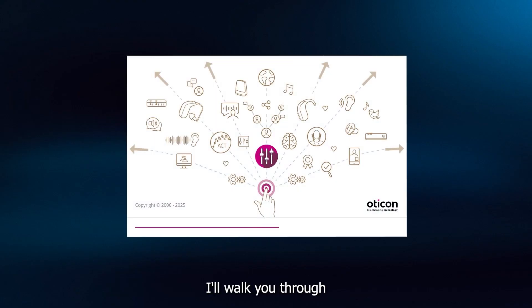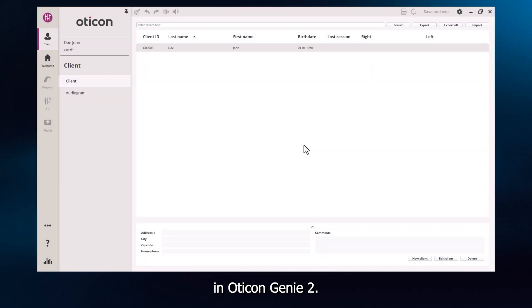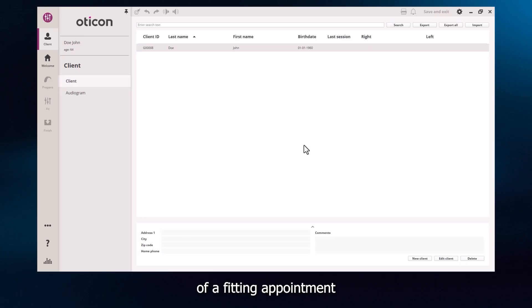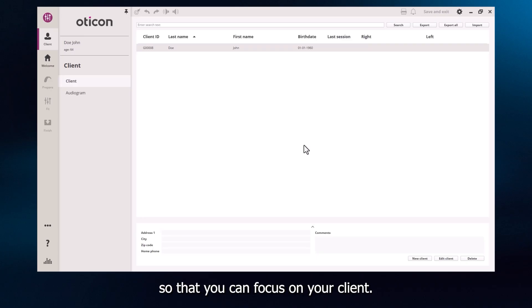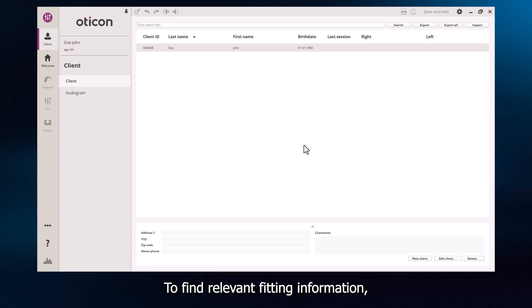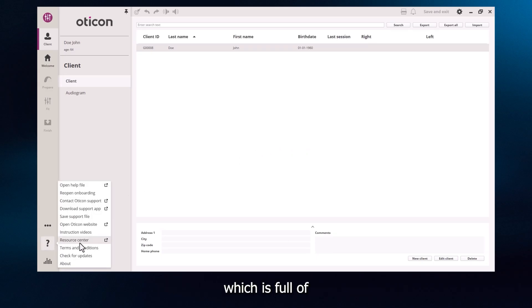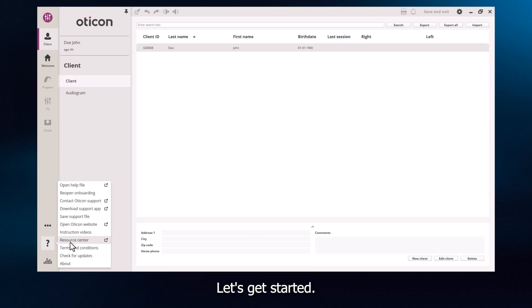In this video, I'll walk you through how to perform a great first fitting in Oticon Genie 2. The fitting software aligns with the structure of a fitting appointment so that you can focus on your client. To find relevant fitting information, we recommend looking at the Resource Centre, which is full of helpful guides and videos. Let's get started.